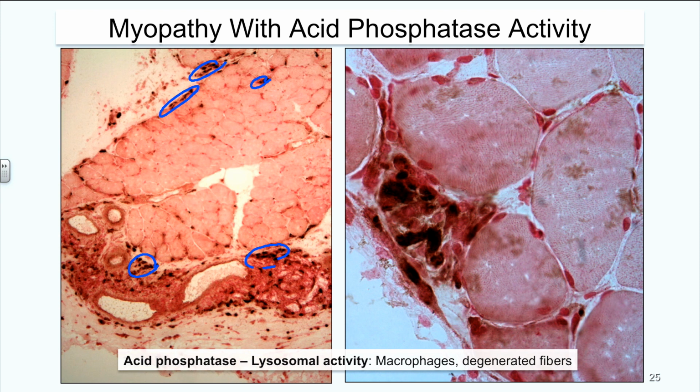They can be part of the first crew that attacks the muscle, part of the crew that comes to signal regeneration, or part of the crew that comes to clean up the muscle. At any rate, we can see them very clearly on the skeletal muscle if there is anything going on. Here you have a myofiber totally invaded by the macrophages because they're cleaning up a dead myofiber.